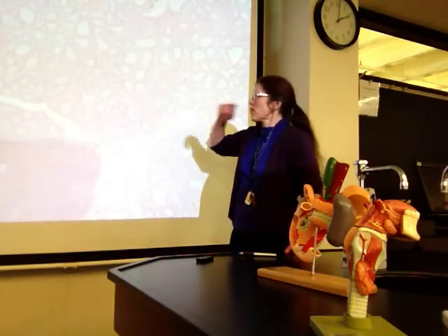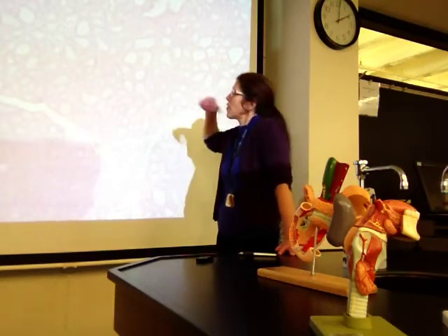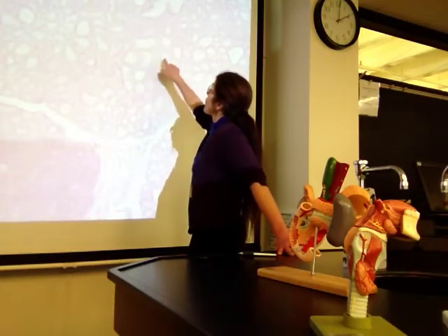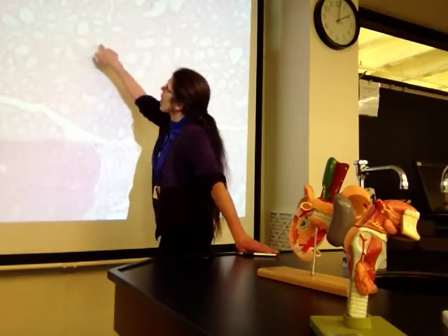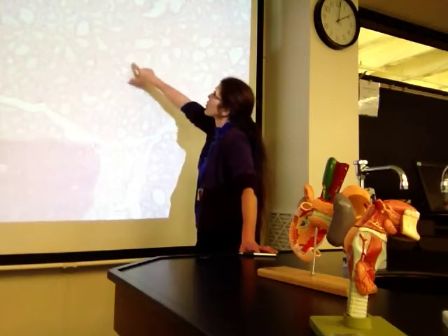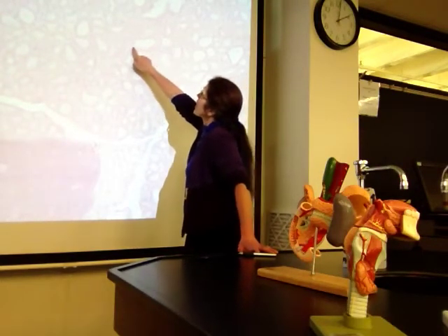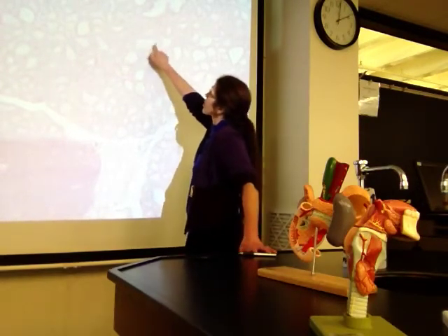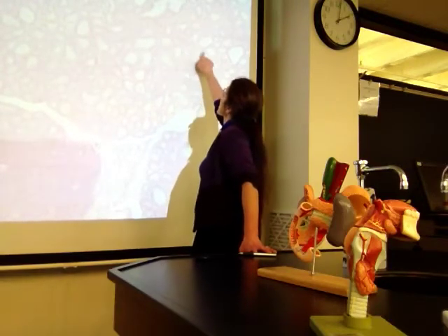So here, this is under a magnification of 10x, and that's probably what we'll ask you to know it under. You see a lot of these structures, and you see the open areas, the contrast in staining. All these open areas are filled with the hormone, so they're non-cellular, they're a secretion. The actual hormone is a substance of chemical secretion. Whereas here are the cells, and these are basically simple cuboidal cells in this case, that surround this open area, and in this case, and in this case.